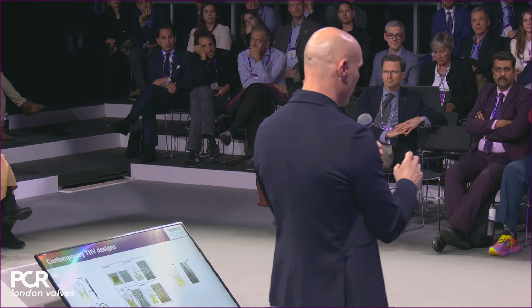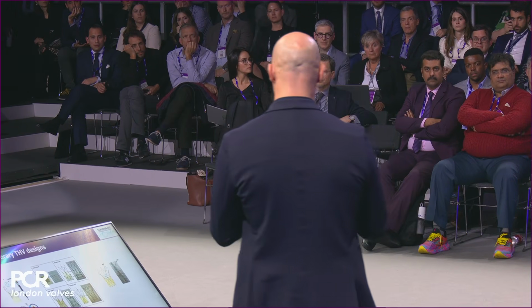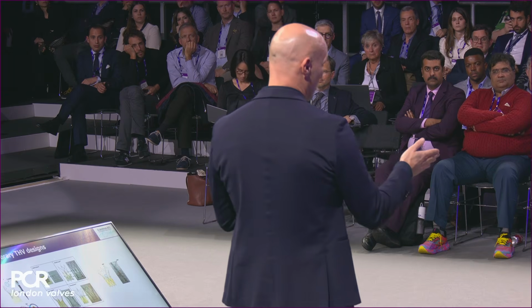Okay. Well, honestly, I have a right radial approach in all my native coronary cases. In TAVI, it depends on the size of the ascending aorta. If it's a small aorta, then your maneuverability through a radial approach is very limited, especially with a right radial. So then I would prefer, at 3 a.m. in the morning, I want to get back to my bed, so I would go for a femoral.